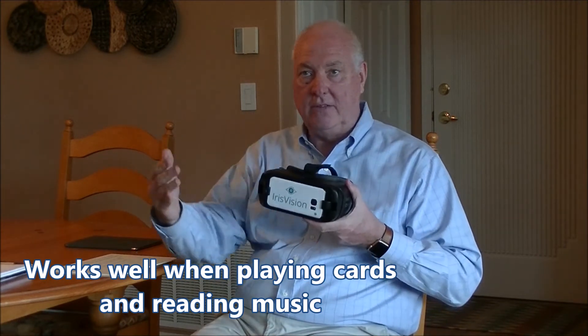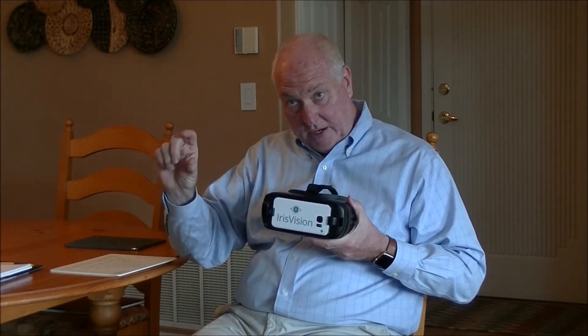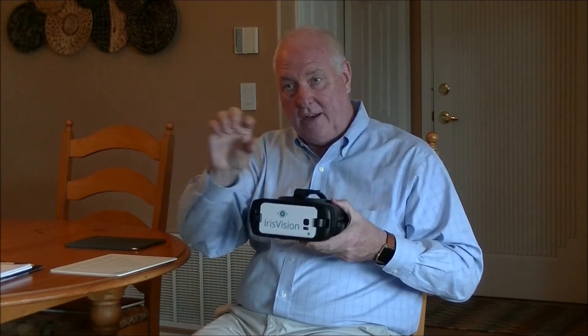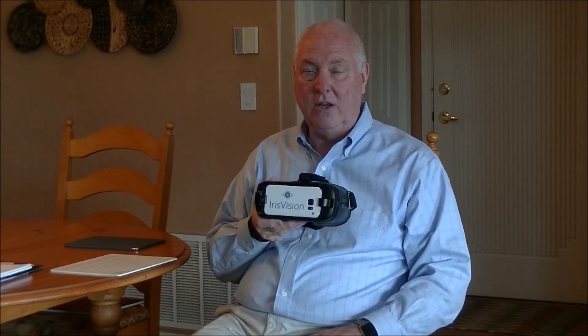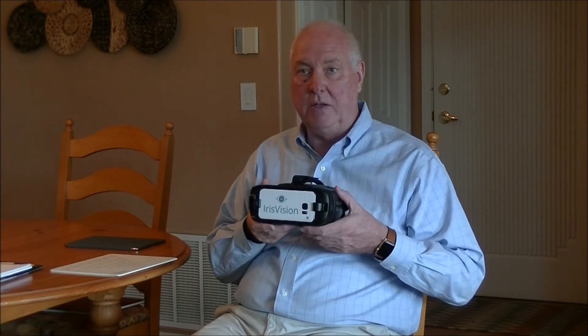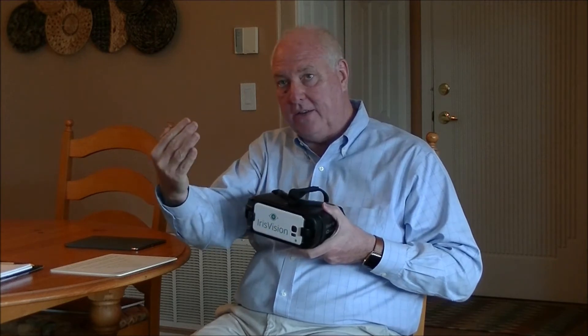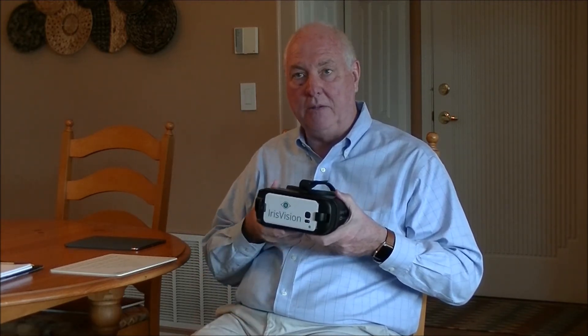Music is another thing that's difficult at intermediate distances, and this is what the Iris Vision is really good at. I worked with a gentleman who had tried other wearable devices and he was able to zoom in on one line of music, but he told me he plays the organ. On organ music, the top line is the right hand, the next line down was the left hand, and the next line down was the pedals. He couldn't use any other devices because he was only able to see one line. With the Iris, he was able to zoom in at a good intermediate distance and actually saw four lines at one time, and he was just thrilled.